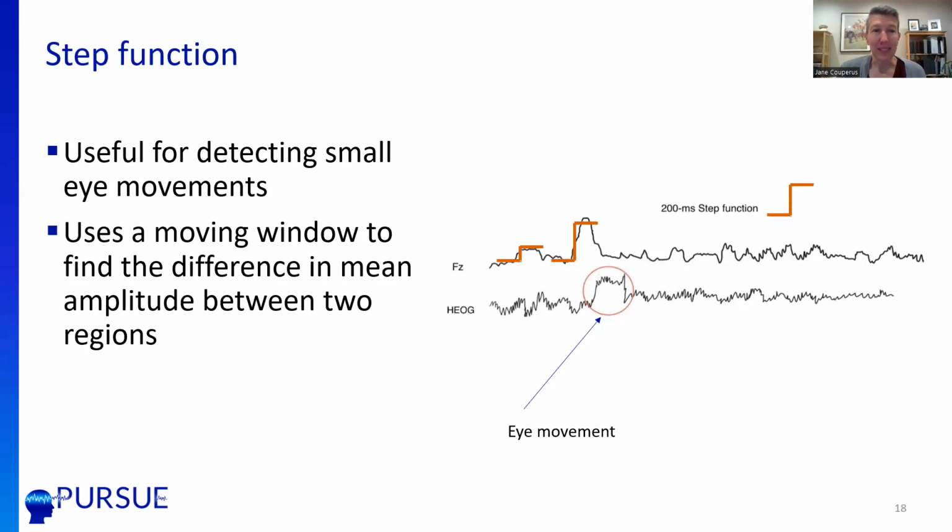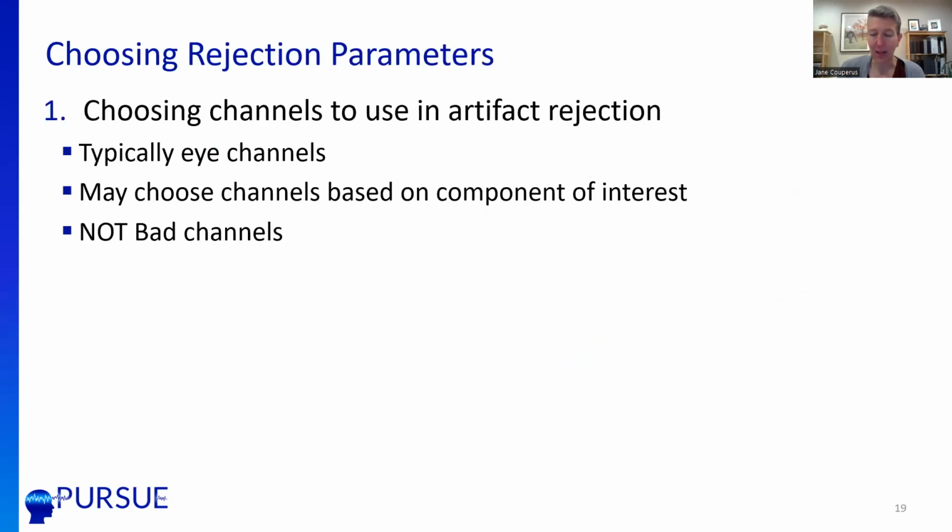Finally, there's something called the step function. This is useful for detecting small eye movements, and it uses a moving window to find the difference in mean amplitude between two regions. So this is good for picking up things like saccades because it's taking an average of each little area, and then it's averaging those and then comparing how far they are apart from each other. So in this case, it's a 200 millisecond step function, and it's going to be checking those.